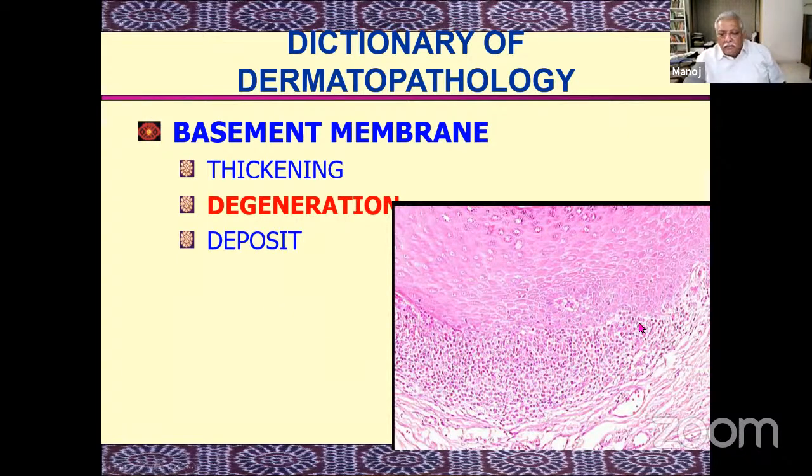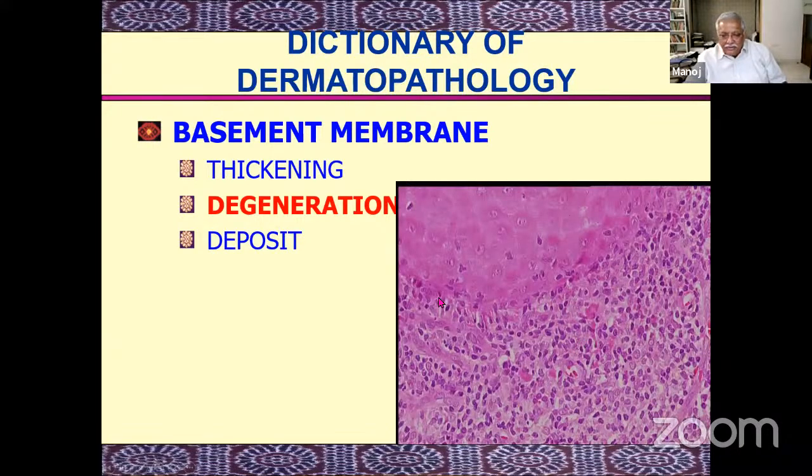And once again, we are back at our lichen planus. You can make out here that there is a lot of inflammation in the upper dermis. A little bit of basement membrane-like material you can make out here. Here it's not there at all. It's gone, absent. And some people use the term that the basement membrane is destroyed, but it's fine to use that term. But actually what has happened is it's not formed at all. It is absent.